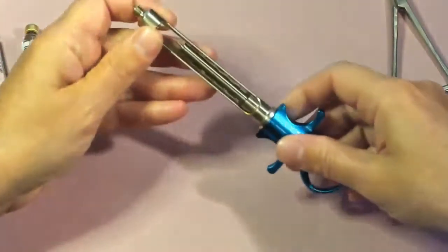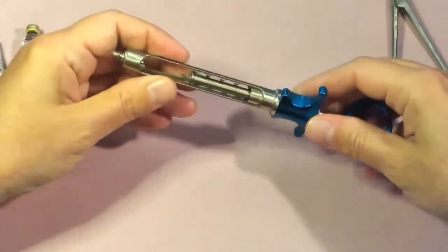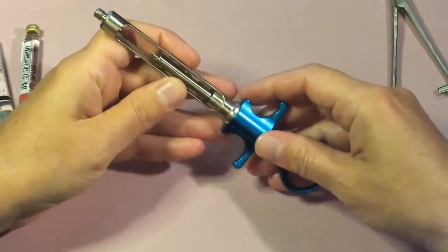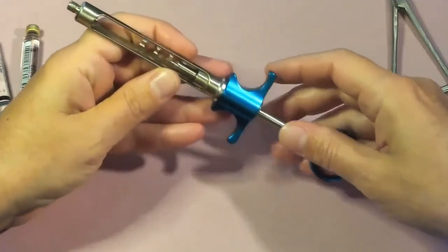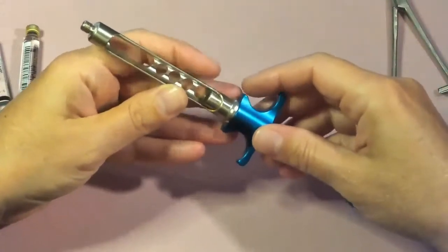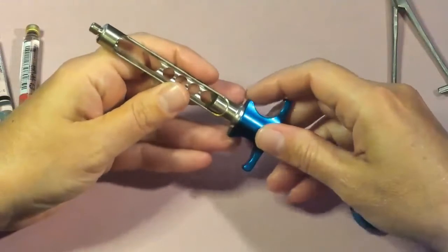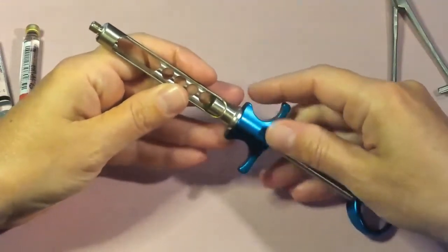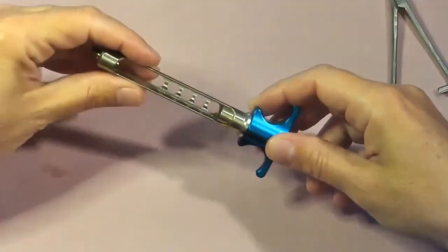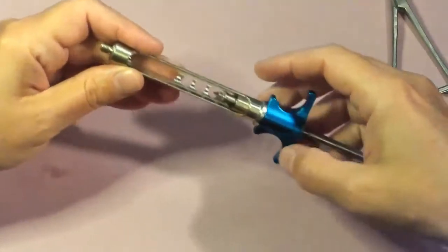Next we have the syringe. For safety purposes, we always recommend using an aspirating syringe so that we can aspirate. Aspiration is drawing into the cartridge so that we can ensure we are not in a blood vessel when we deposit the anesthetic at our target. That helps reduce the risk of toxicity for our patients and ensures the most safe technique.